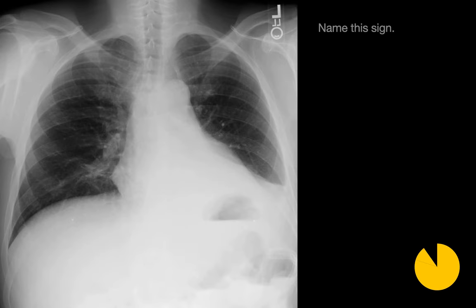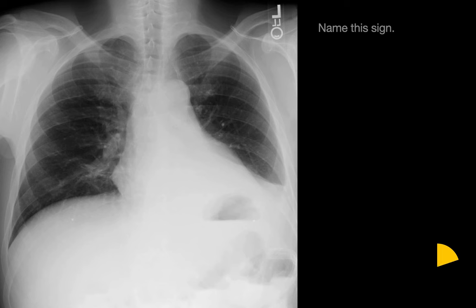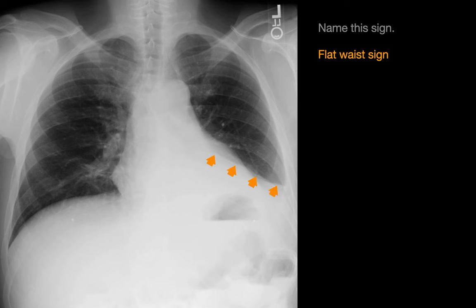Name this sign. In the lower left chest on this image we see two relatively sharp linear interfaces. One corresponds to the cardiac silhouette and the other corresponds to a flat waist sign.